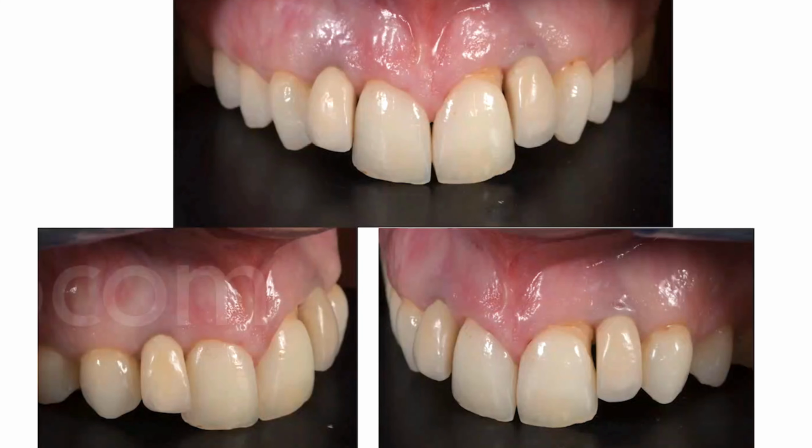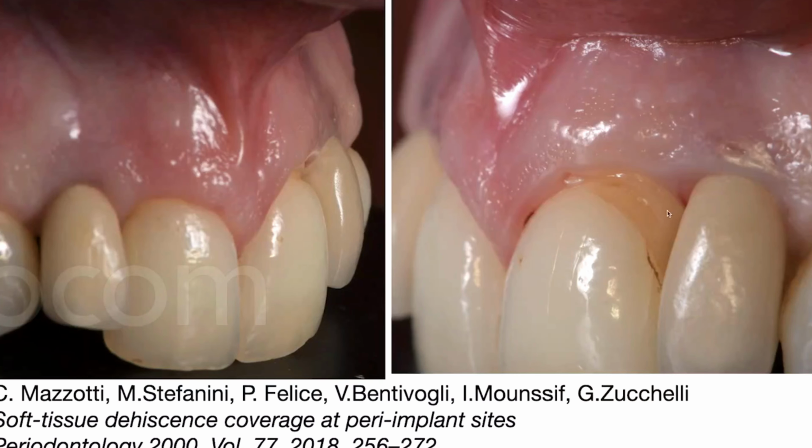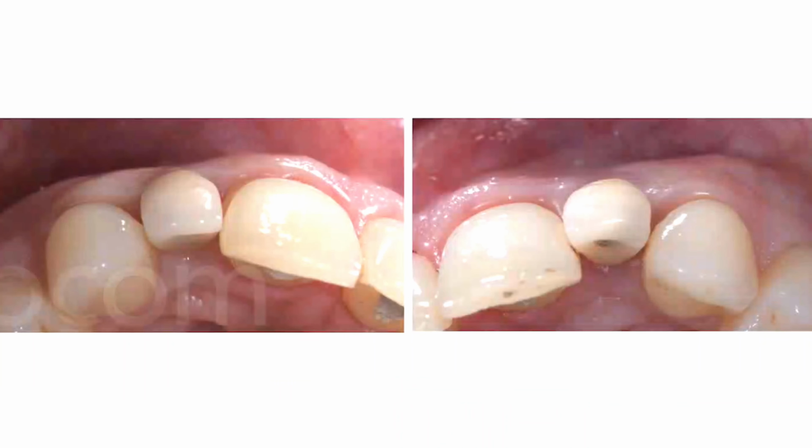When there is such a failure and there is no space between one implant and a tooth, we are always touching the topic of proximity. How can we solve this proximity? We saw that there is some surgical solution. There is some solution which needs tooth extraction. In this case, the implant and the tooth are attached. But the implant, we can remove the crown.